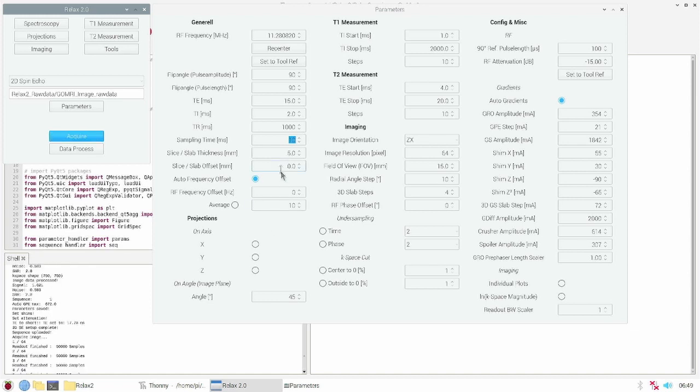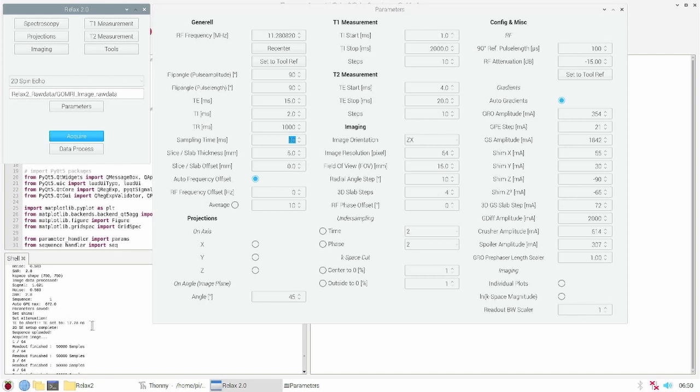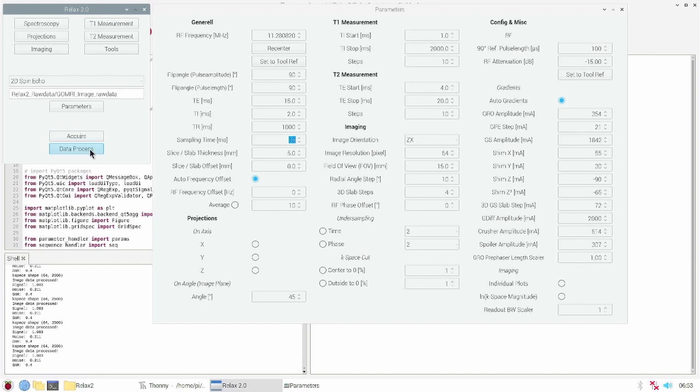When the sampling time is too long for the short TE time, the software will detect that and will set the TE time to a minimum needed value. After the acquisition we can reconstruct the image by clicking on data process.